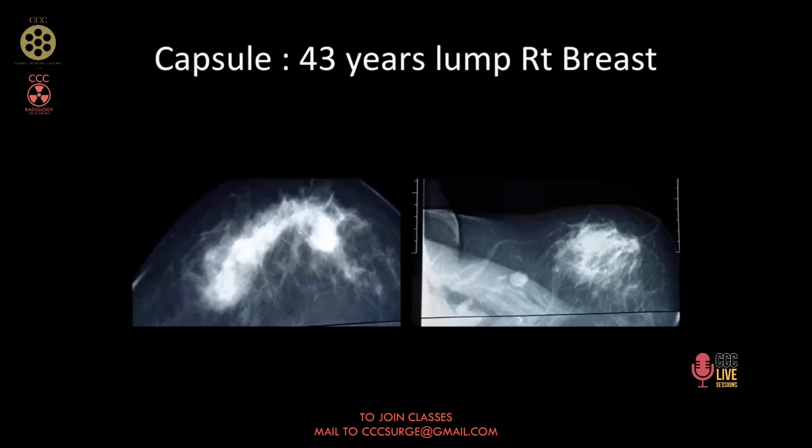Now we come to the next one. Now look here. Again, as you see, there is a clear-cut lesion here. Now I am unable to expand it, but if I could expand it, I would have shown, go very close, you are going to find small dots of microcalcification in this particular area. In a computer, you need to magnify digitally hugely to understand that there are pleomorphic clustered microcalcifications, or else you are just going to look and say, oh, there is an architectural distortion. But what is the implication of having microcalcification here? The implication is it is extratumoral microcalcification.